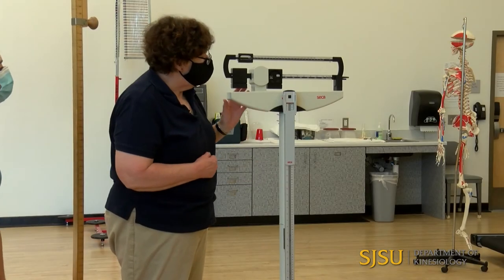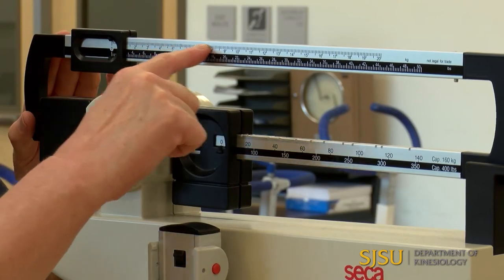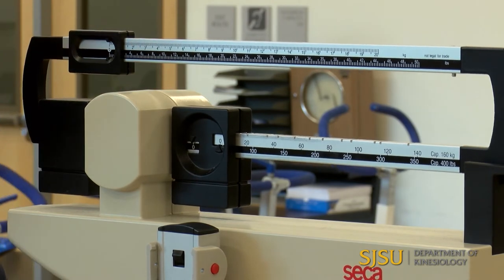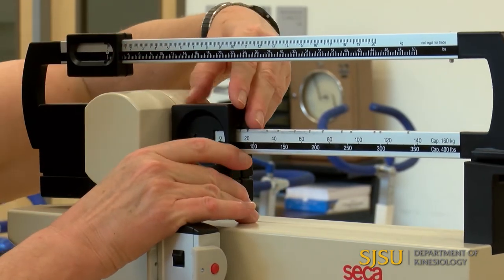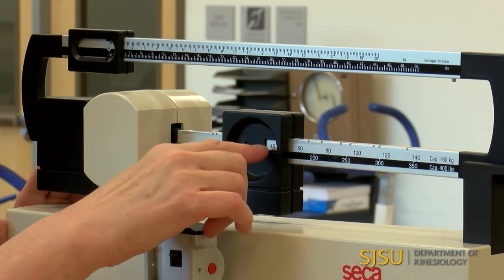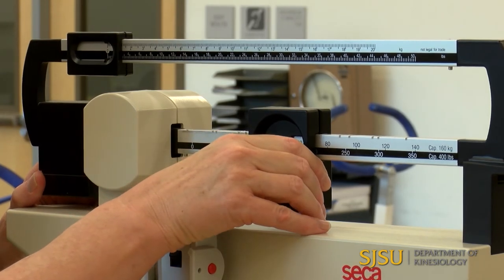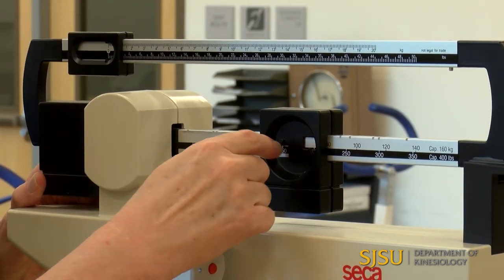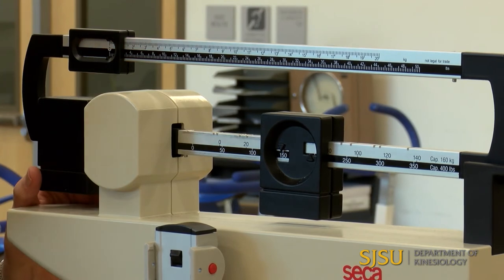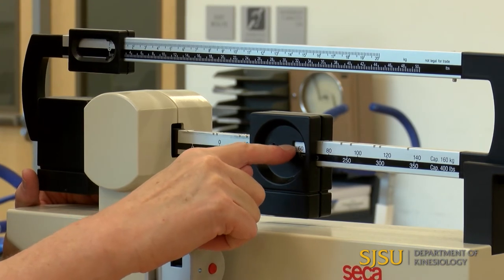To measure weight, we're going to use the physician's scale. This particular scale has two units of measurement: the silver markings are kilograms and the black are pounds, so you need to make sure you're in the correct unit. When I see a number in the silver window, that's kilograms — for example, 40 kilograms. The black number in the bottom window is pounds, for example 150 pounds. I'm going to measure kilograms — if I move it there I see 60 in the silver markings, 60 kilograms.